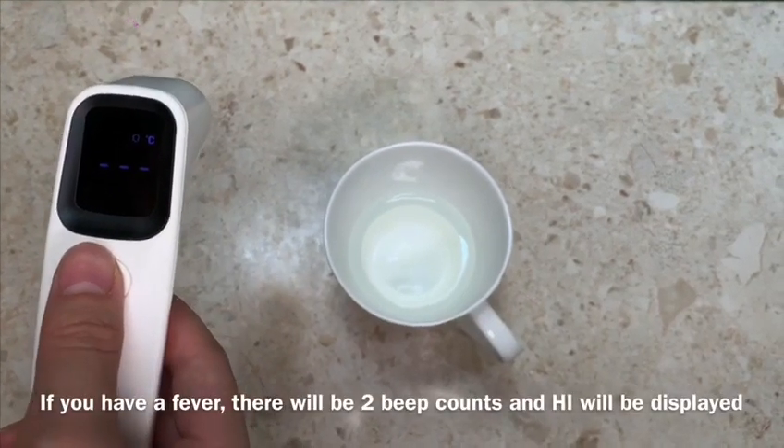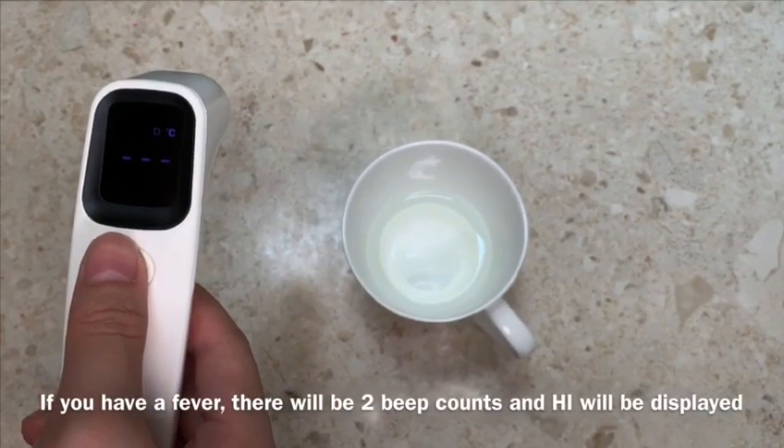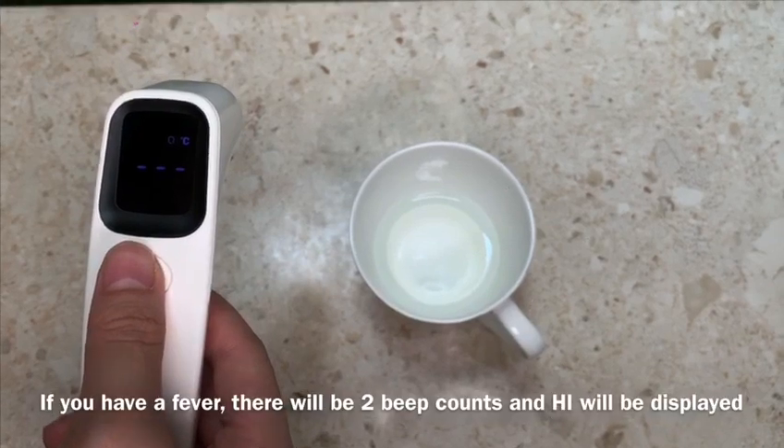Here we have a cup of hot water. If you have a fever, there will be two beep counts followed by 'high' as displayed.